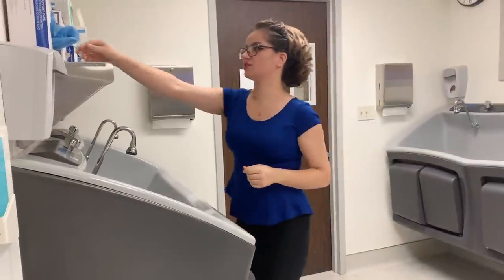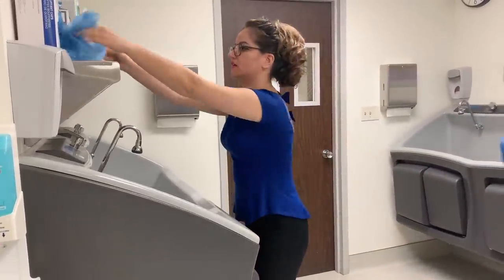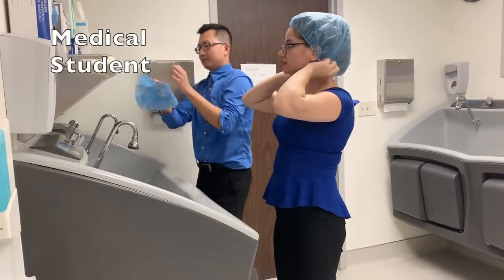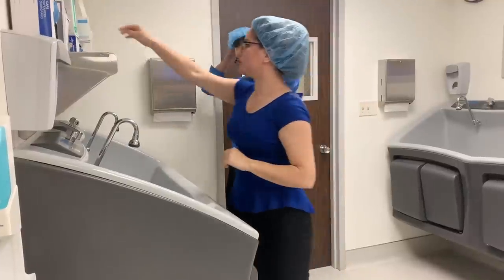Key things are: you want to cover your hair whenever you do any procedure, and you want to put on your mask.